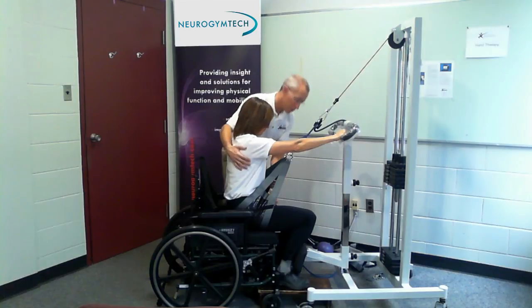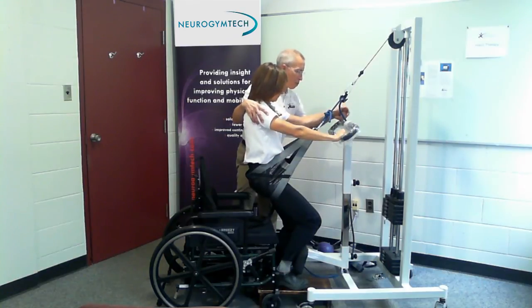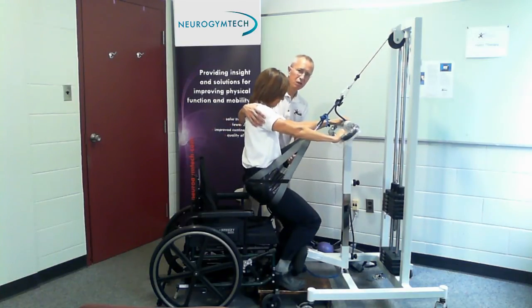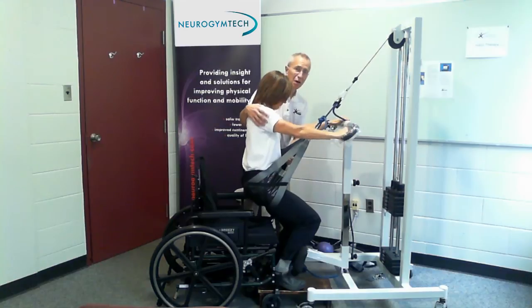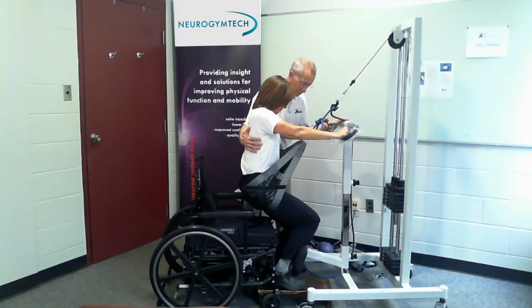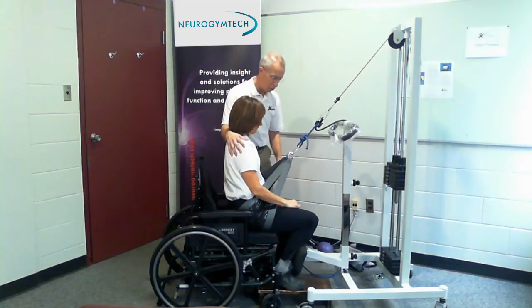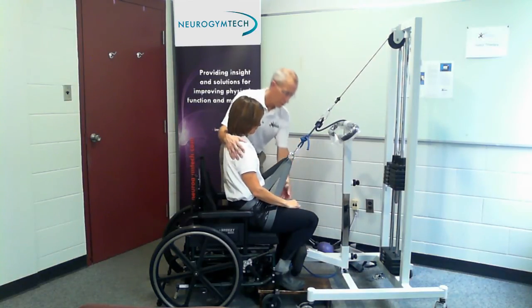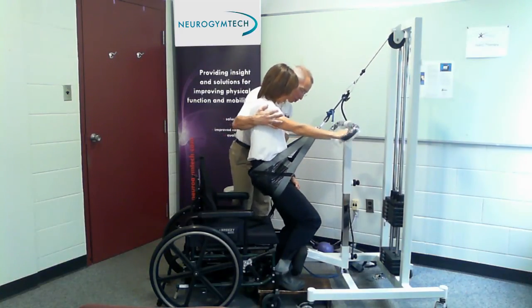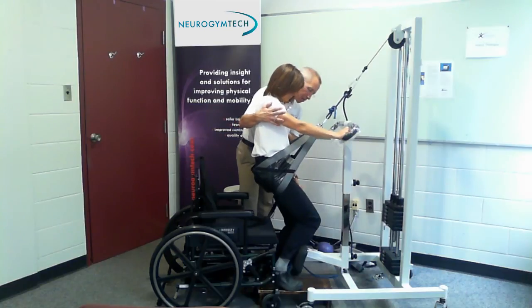Now she's going to come up, and we're going to take the affected arm and put it up here on the handlebar, then come halfway down and slow. We just added range of motion of the affected shoulder — another key objective for somebody who's hemiplegic. Now we're going to do a little weight bearing on the affected shoulder. Put your good arm up and come on up — I'm going to hold her on the shoulder and just get her to lean a bit this way and back, lean a bit this way and back. We're just doing a little weight bearing on that affected side.